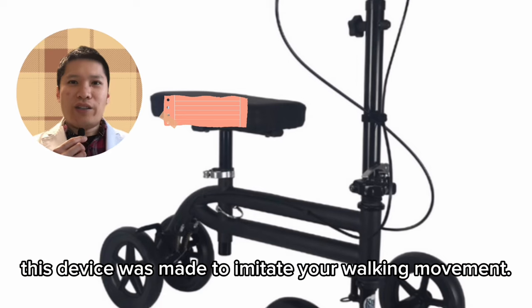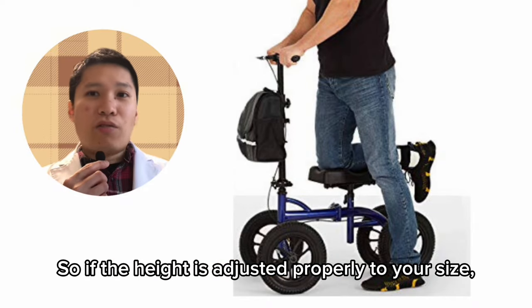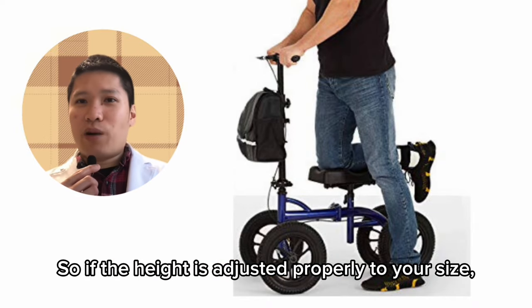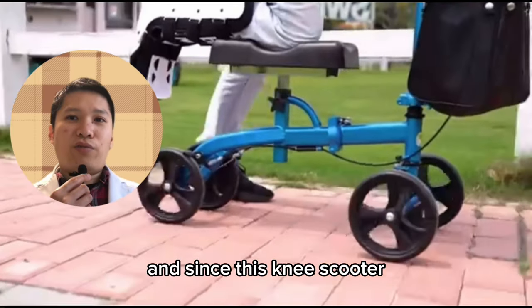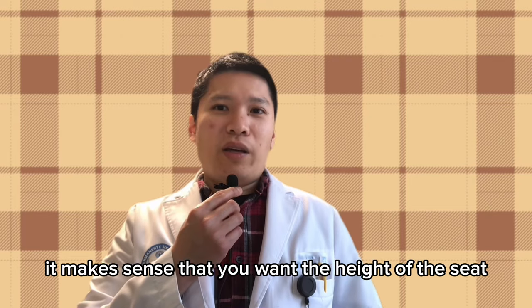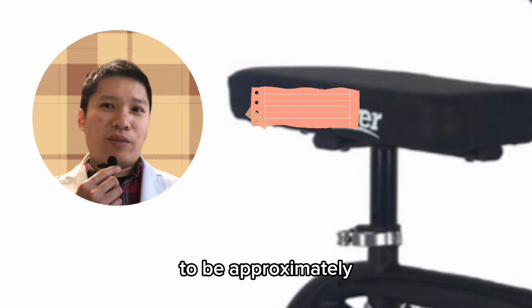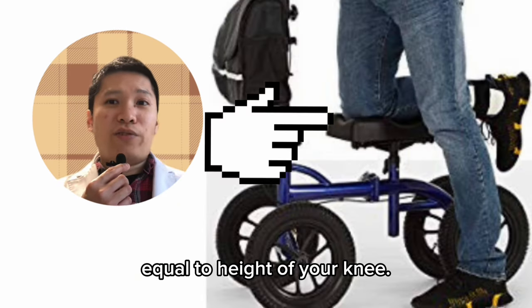Originally, this device was made to imitate your walking movement. So if the height is adjusted properly to your size, it should be very comfortable. And since this knee scooter was created to be an extension of your leg, it makes sense that you want the height of the seat to be approximately equal to the height of your knee.